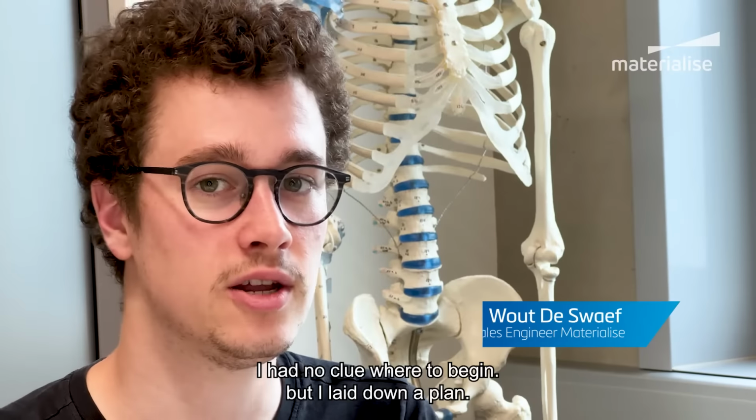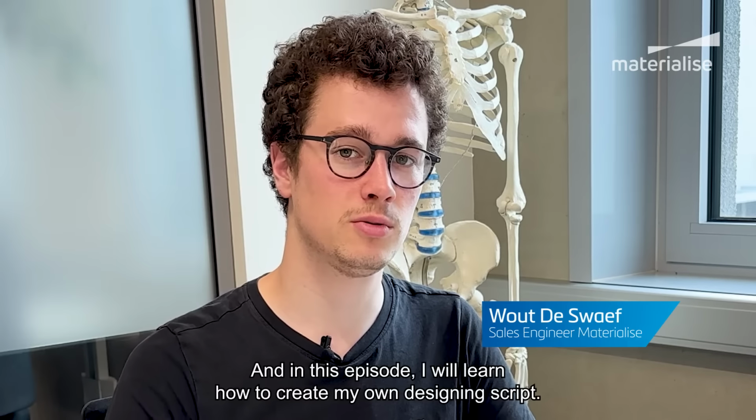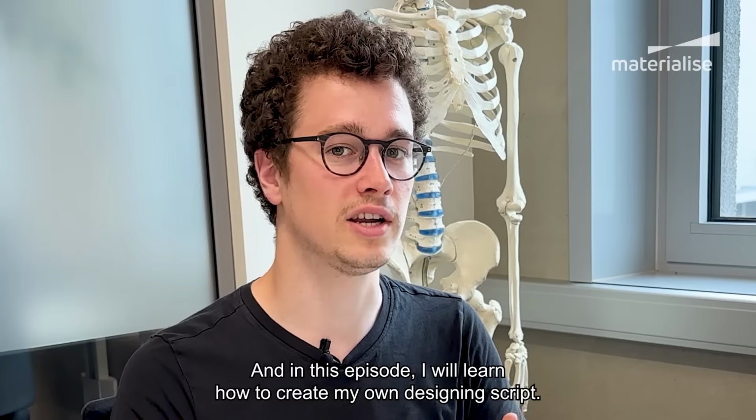I had no clue where to begin, but I laid down a plan. And in this episode, I will learn how to create my own designing script.